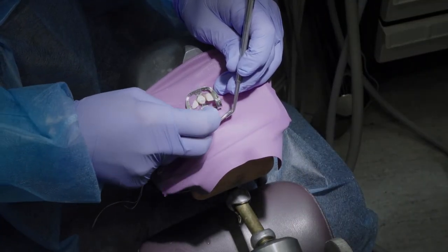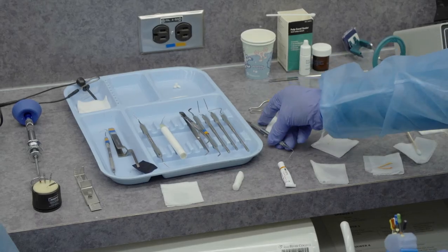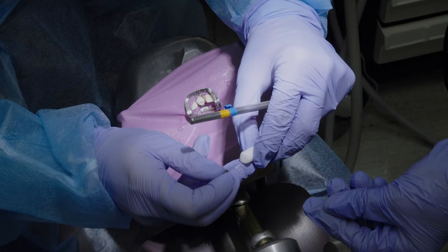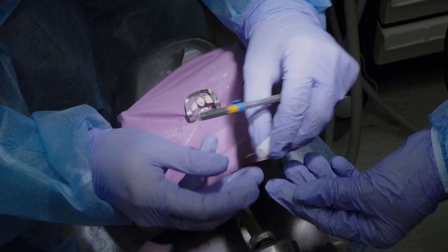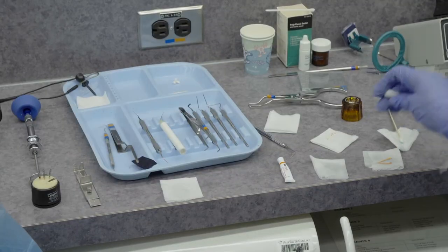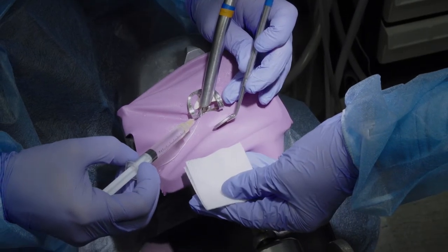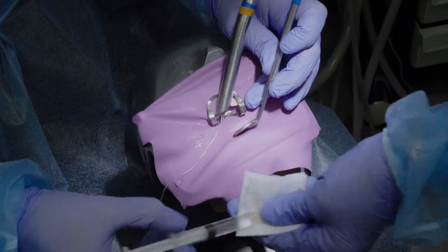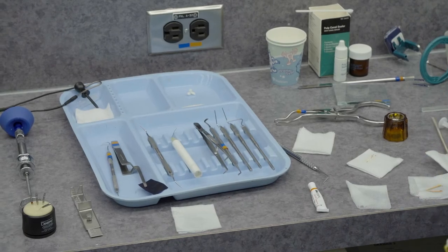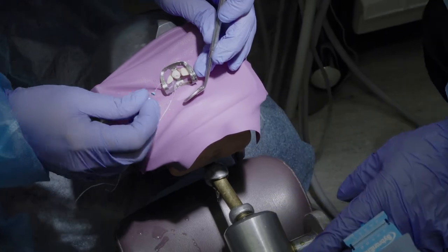Once the dentist has found the canal opening, the dentist is going to utilize the barb broach. And the assistant is going to pass a cotton roll soaked with sodium hypochlorite and then pass the sodium hypochlorite to the dentist for rinsing. The assistant will then pass the 15 size file to the dentist within the apex locator. This is to determine the working length.